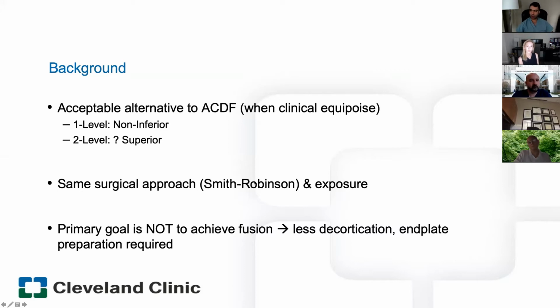The approach for arthroplasty is essentially the exact same surgery as you would do for an ACDF. It's just the classic Smith-Robinson technique.